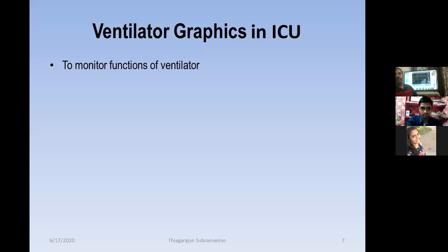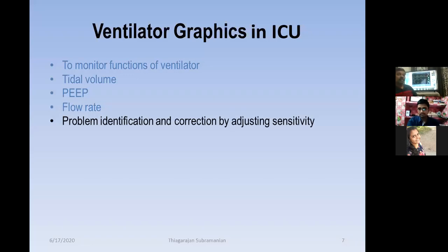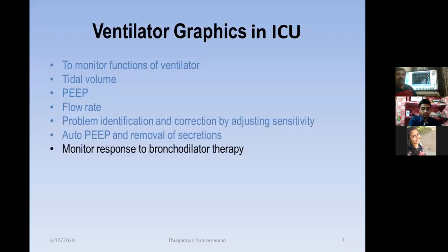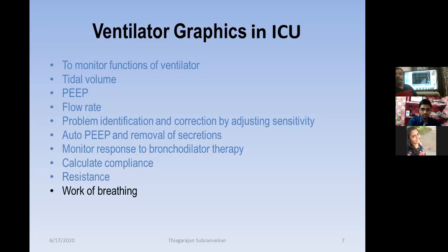And also to check for the auto PEEP, and also for the removal of secretions. These are all the major motives which they have found in ventilator graphics in the ICU by the physiotherapists. They have also found a lot of changes with the response of the graphics, and they were able to monitor the response of the bronchodilators, adjust the settings, and calculate the compliance, resistance and work of breathing. All those things can be analyzed by ventilator graphics in the ICU.